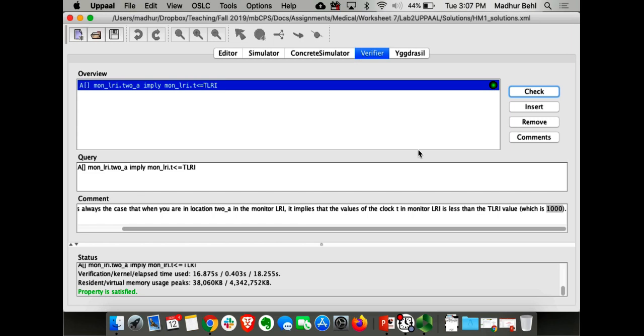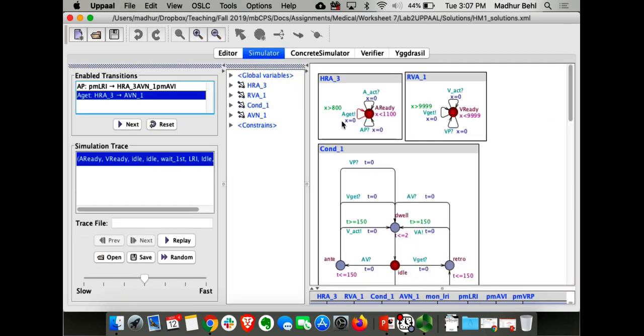So what we have shown is that in this big system, which has the heart plus the pacemaker nodes, we have validated that the pacemaker will always, for all paths being the keyword, be able to prevent bradycardia. And that's powerful. And this is how you design software for medical devices and prove absence of bugs.